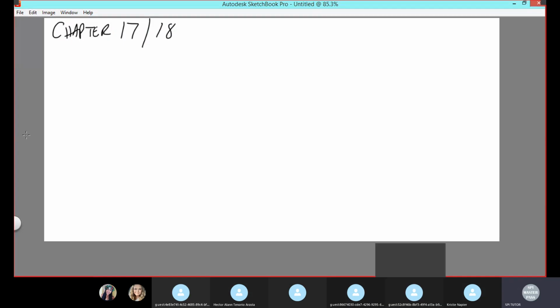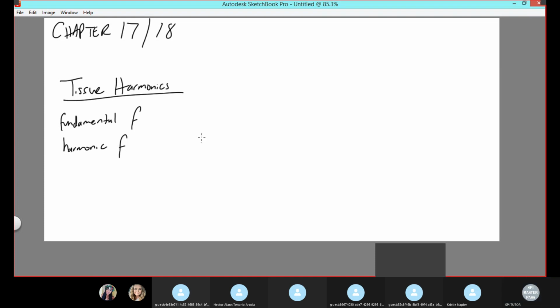All right. So chapter 17 is all about contrast harmonics. For contrast harmonics, you have tissue harmonics and you have contrast harmonics. Those are the two categories. For tissue harmonics, you have what they call a fundamental frequency and then a harmonic frequency. These are the two terms you have to first introduce yourself with.